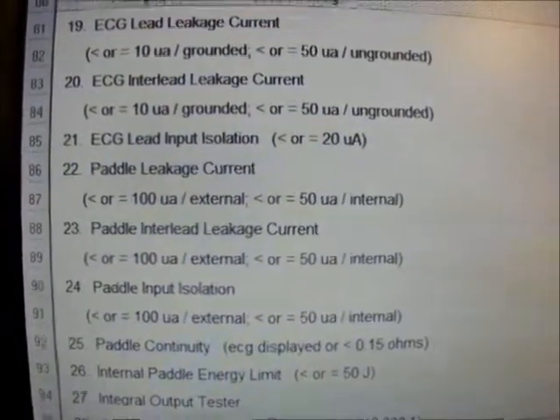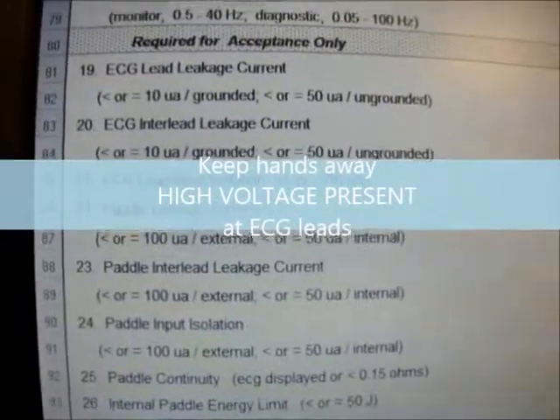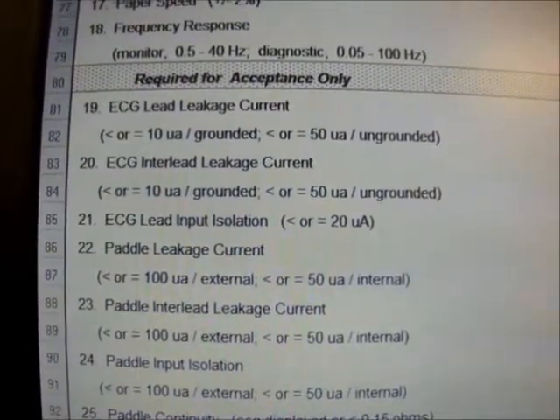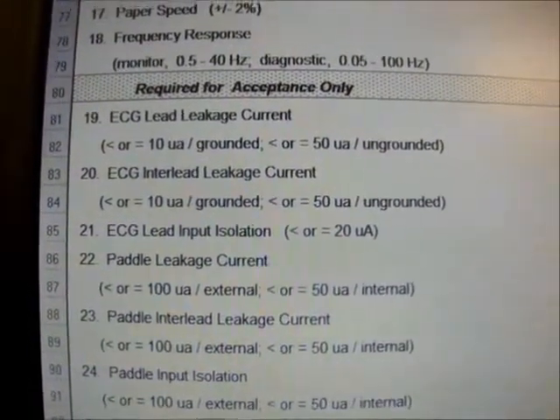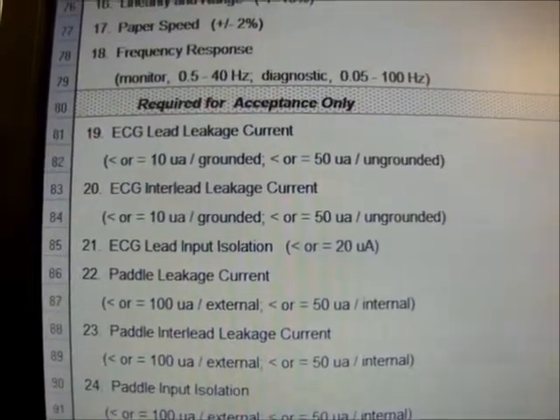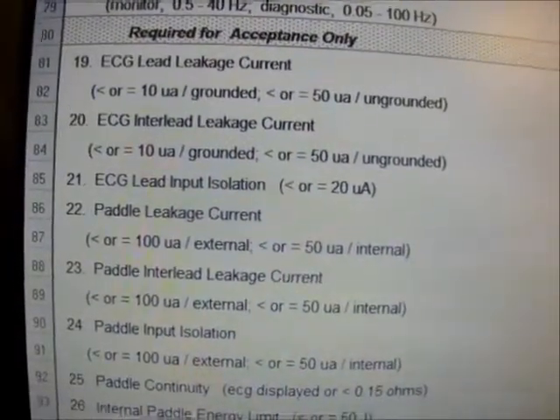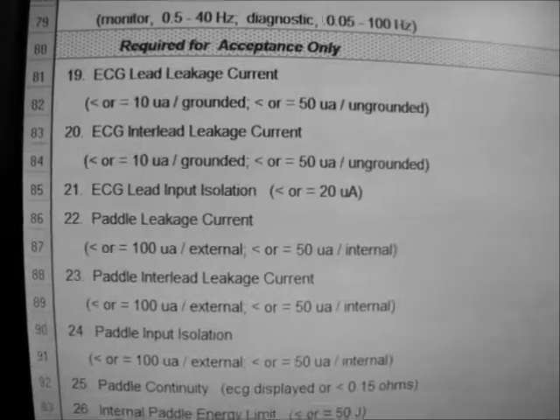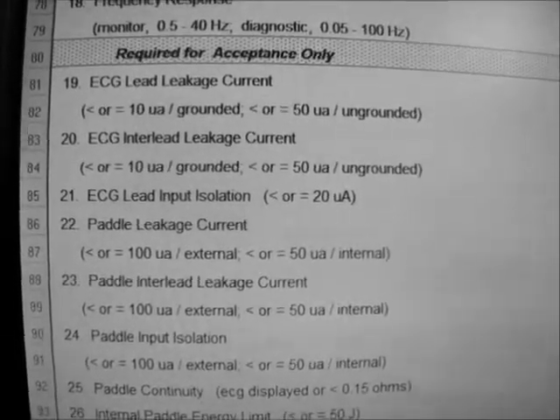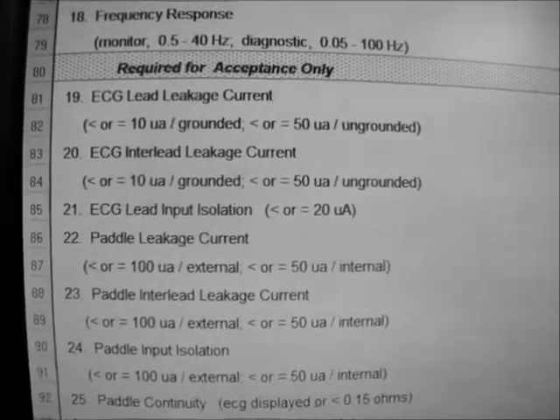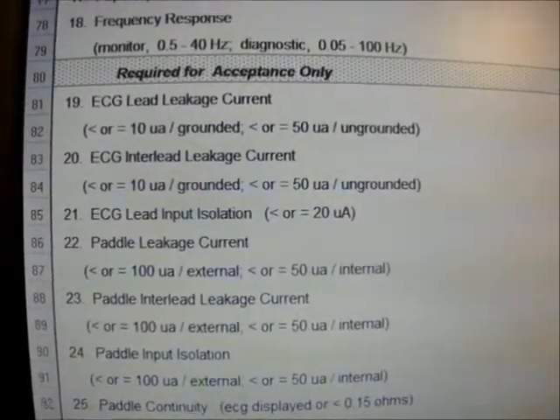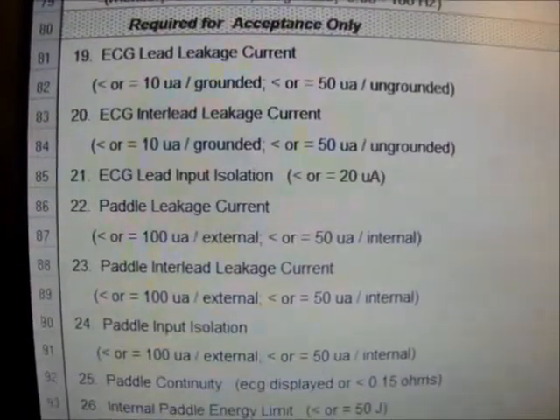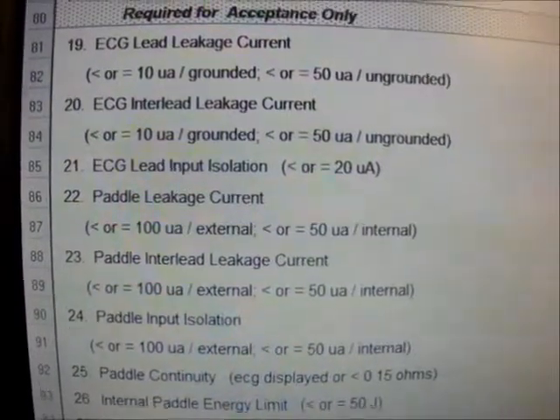ECG lead input isolation — warning: during this test, high voltage is applied and present on the ECG leads, so keep your hands away from the electrical safety analyzer. This test measures the simulated current between the patient when 115 volts AC at 1 mA is applied to ground; that should be less than 20 µA. Paddle leakage current is performed for defibrillators using paddles — the traditional plastic-style handles with a metal plate. We are measuring chassis leakage current that may flow during ECG testing with the paddles to ground. Tolerance is less than 100 µA external or 50 µA internal.